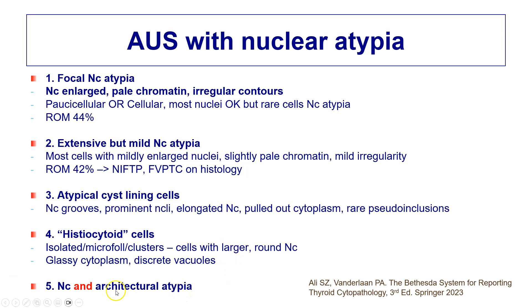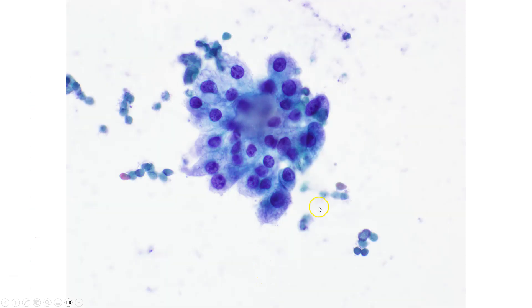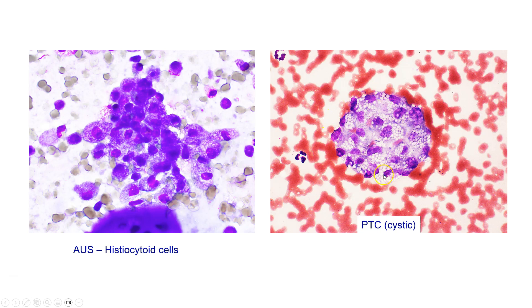This is also inclusive of cases with both nuclear and architectural atypia. Here is an example of atypical histiocytoid cells where the cytoplasm is quite bubbly and the cells are very cohesive — not how histiocytes are usually seen, as they are typically more dispersed. Here again are the atypical histiocytoid cells on air-dried smears, compared with a cluster from a confirmed PTC. In cystic PTC, we often see these types of clusters where cells have bubbly cytoplasm.